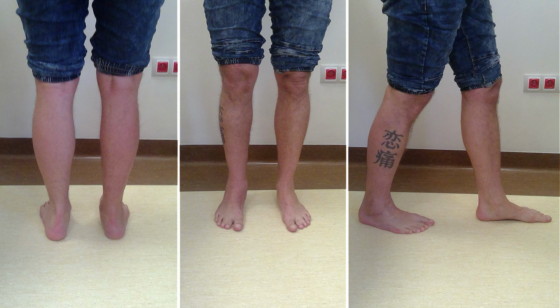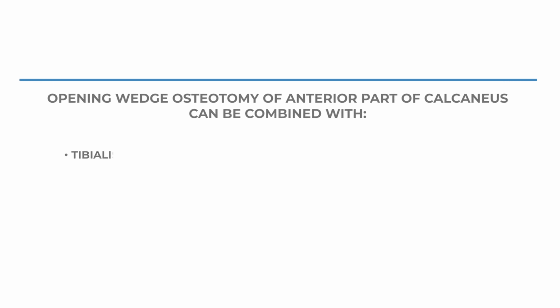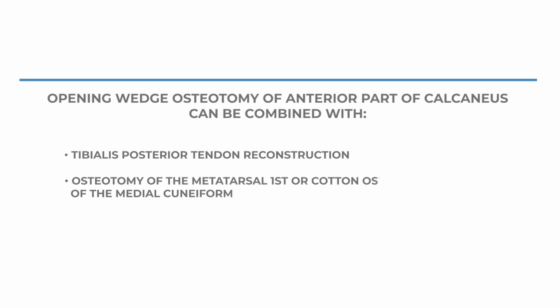This is the clinical appearance after surgery of the right foot. Open wedge osteotomy can be combined with several different procedures visible below.